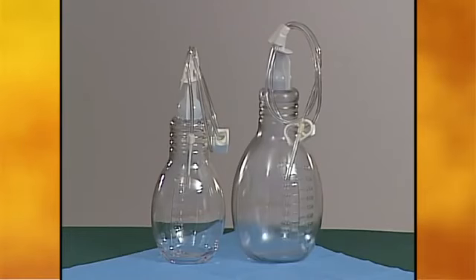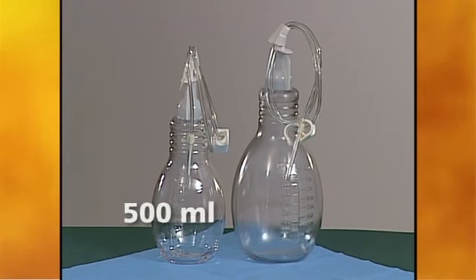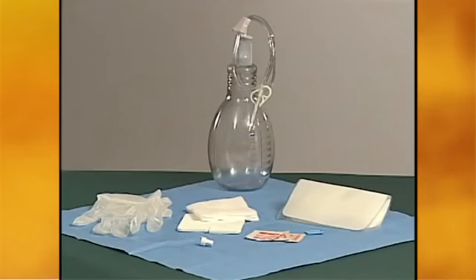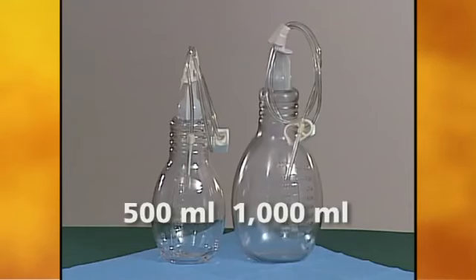Fluid is drained using drainage bottles designed specifically for use with the Plurex catheter. These bottles come in two sizes: 500 milliliters and 1000 milliliters. Bottles come as part of a drainage kit which includes all the items needed to drain at home.